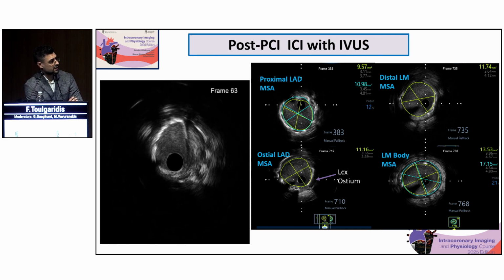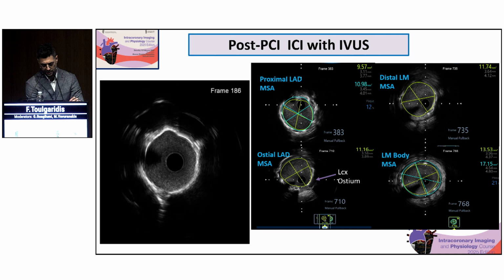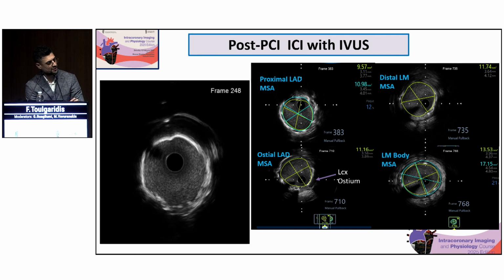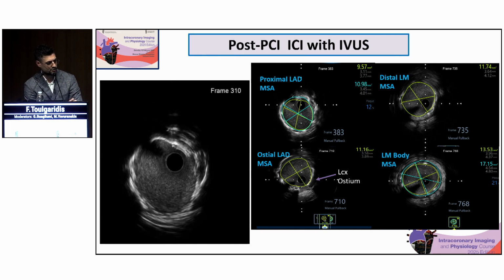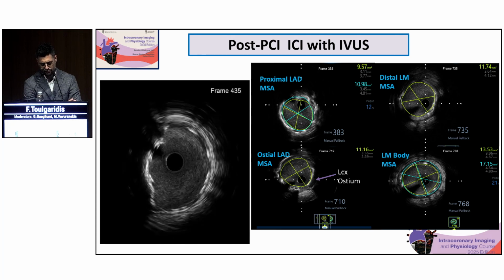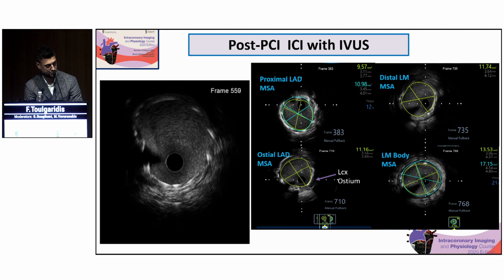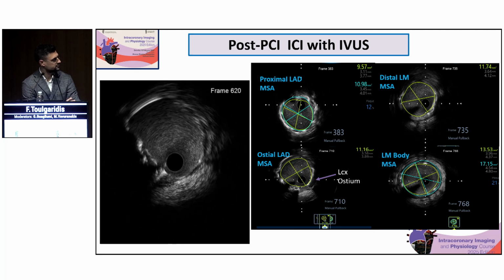Before we finish, as you all highlighted, we also do this in our cath lab, maybe not 3 times in a row when dealing with left main bifurcation, but at least 2, meaning pre and post PCI. We did an IVUS run to check for the result. I will give you some seconds to see the IVUS run and the measurements.